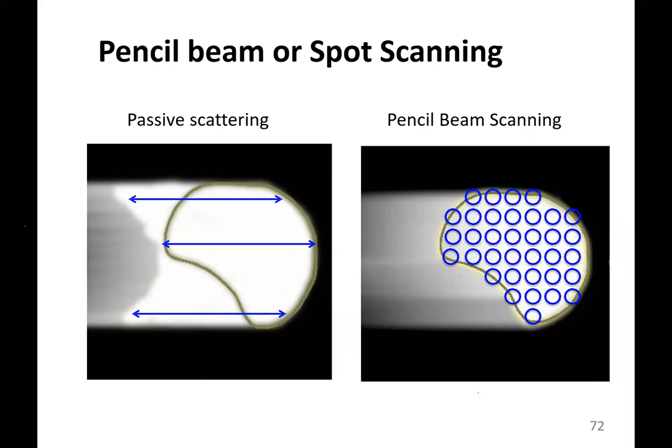All right, there is a second question related to pencil beam scanning that Amir Khatak is asking: why do we move from high energy to low energy? Why not from low to high energy? The reason is, when the proton is giving energy, I will show you the proton plans. We cannot give the beam from any direction. We have to look from which direction we are delivering the dose. So in proton we always try to give the dose to the distal edge first and then go to the proximal edge.